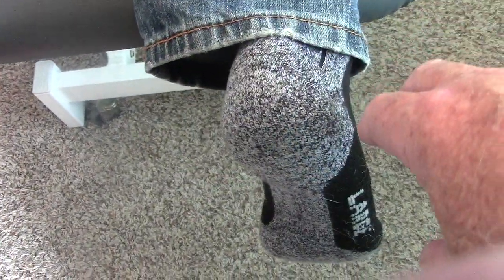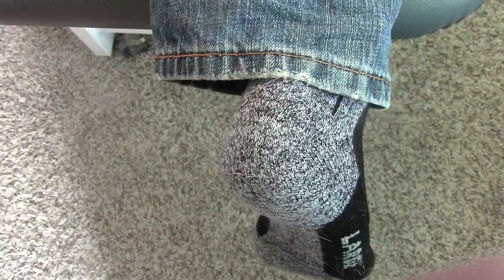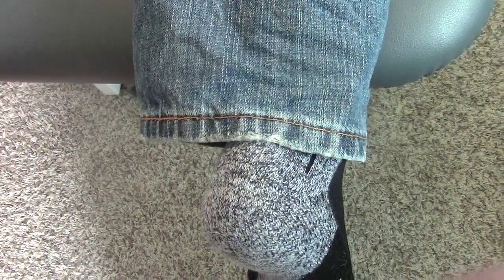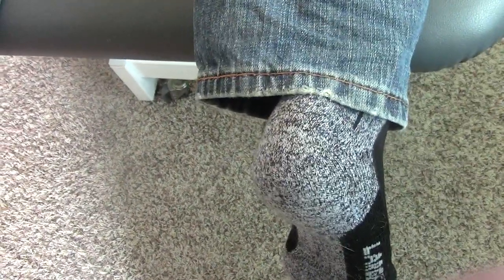Some people need a wedge on the outside and some people need a wedge on the inside. You can find them on the internet, and you can have your healthcare practitioner screen you and see if that's helpful to you. It's an experiment — we're starting out with a four millimeter height, but he also has a seven millimeter height, and he's going to experiment and see which one he likes best.